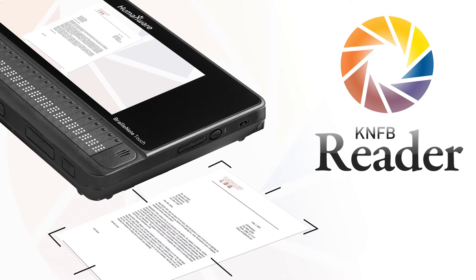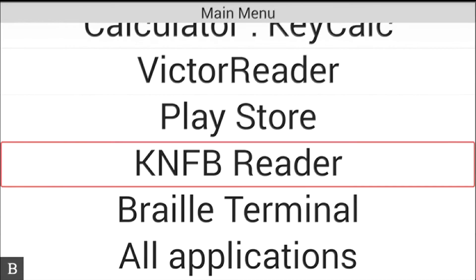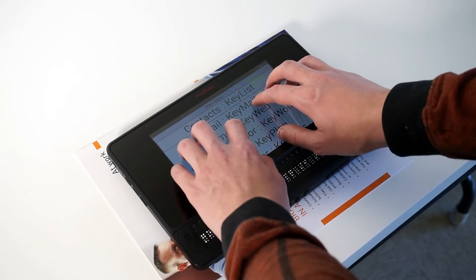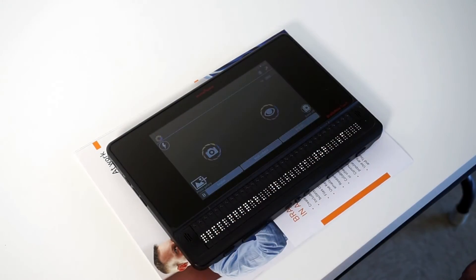Included with your BrailleNote Touch since Touch version 2.0 is the KNFB Reader application. This powerful app can turn print material into Braille in seconds. To find the KNFB Reader app, go to your Touch's main menu and press the letter K to jump to KNFB Reader. Activate that with an Enter key or the cursor router key.